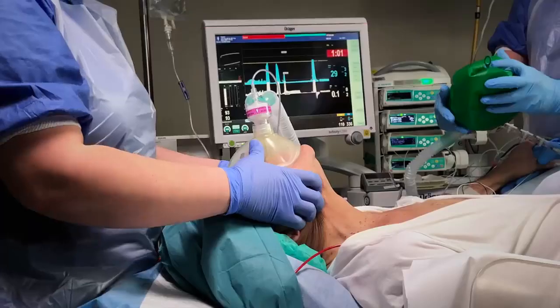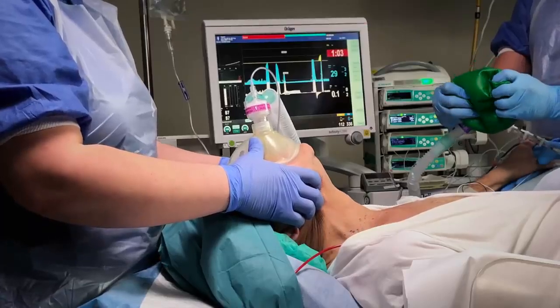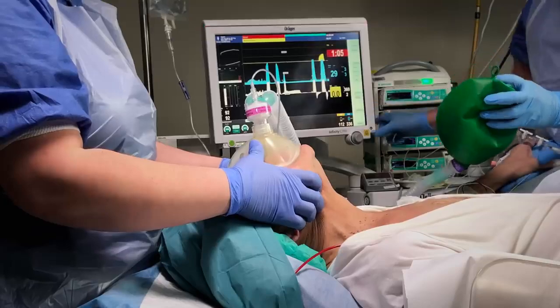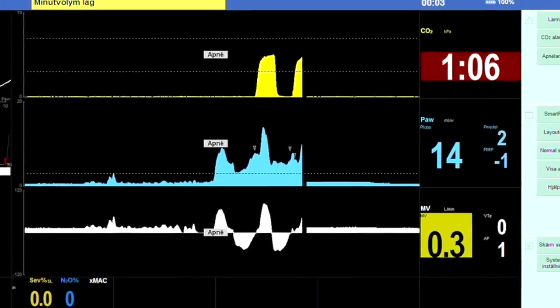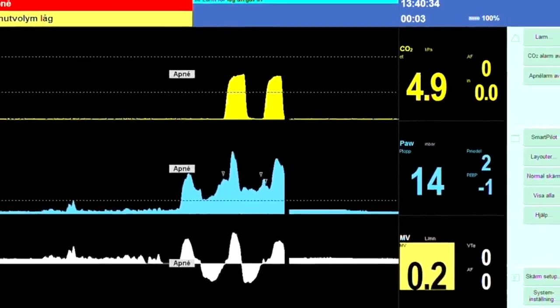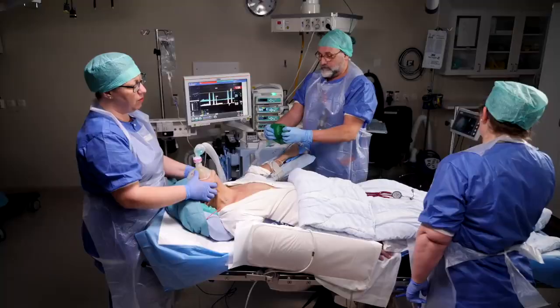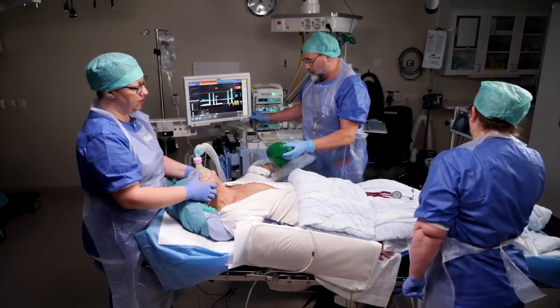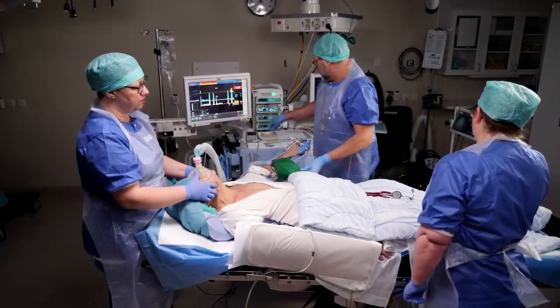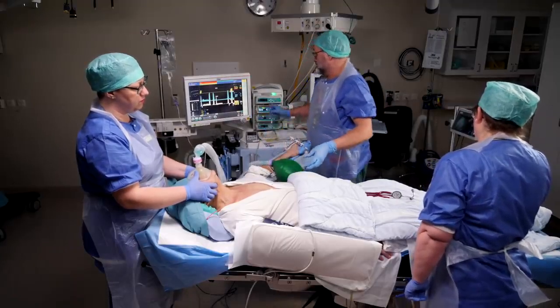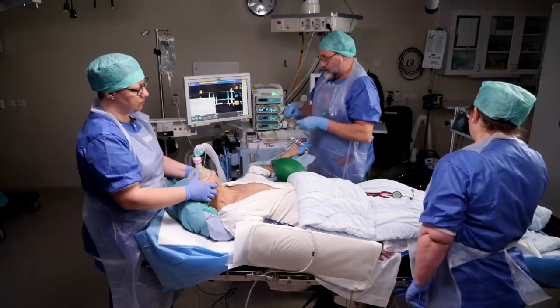Successful ventilation is confirmed by observing the chest wall rising and regular end-tidal CO2 waves on the monitor. If you cannot ventilate the patient at this point, you need to use other equipment and techniques that we will demonstrate in forthcoming videos.